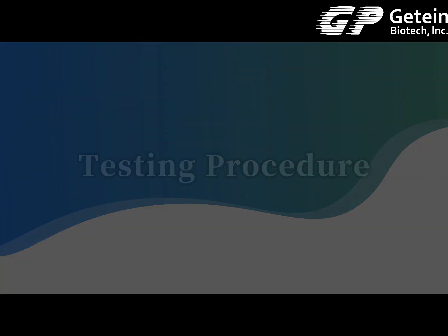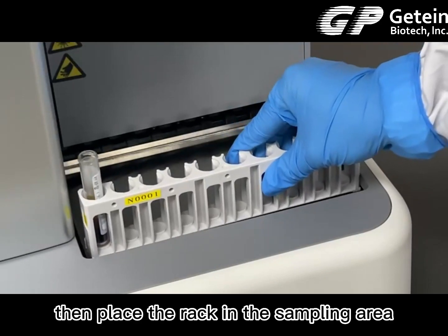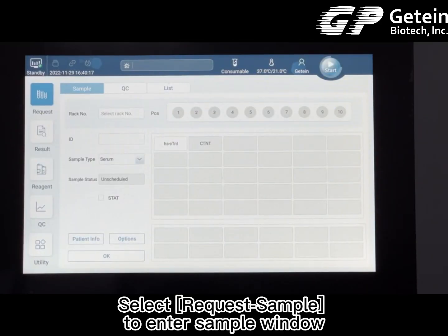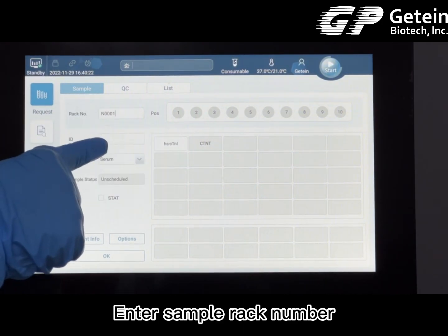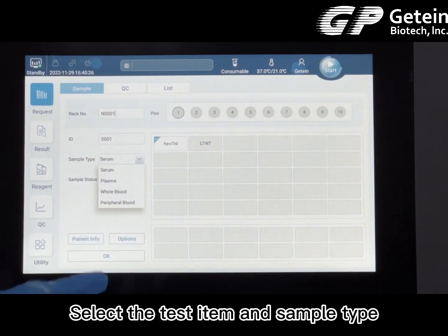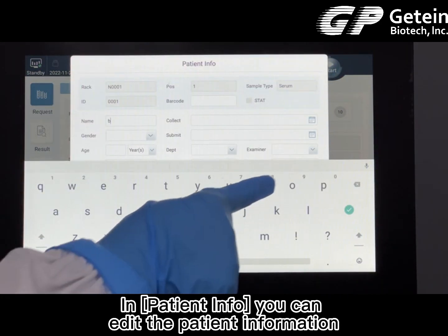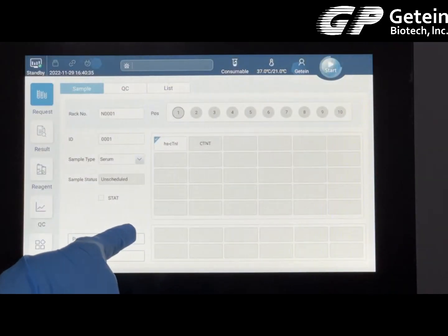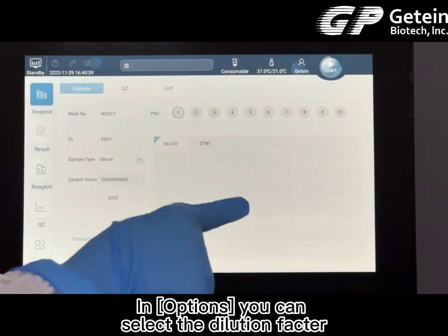Testing procedure: place the sample on the sample rack, then place the rack in the sampling area. Select Request Sample to enter the sample window. Enter the sample rack number, select the position, select the test item and sample type. In Patient Info, you can edit the patient information. In Options, you can select the dilution factor and the number of repetitions.